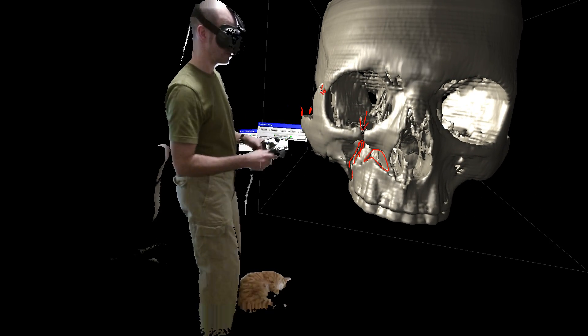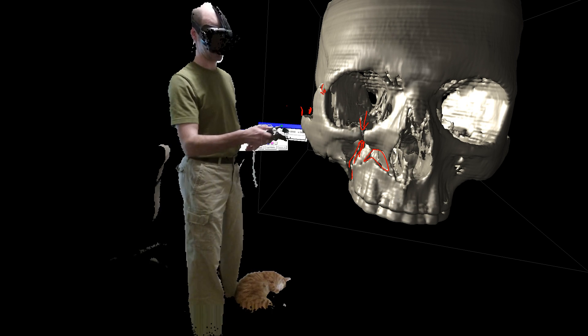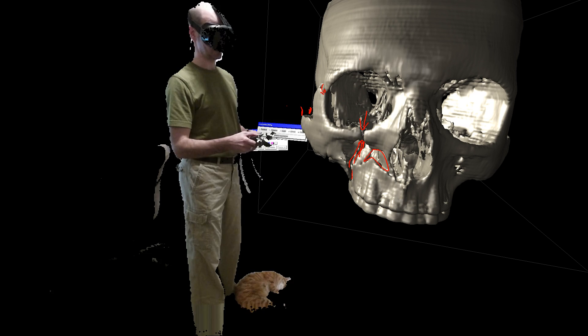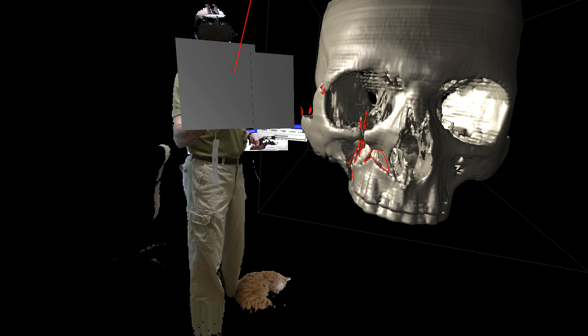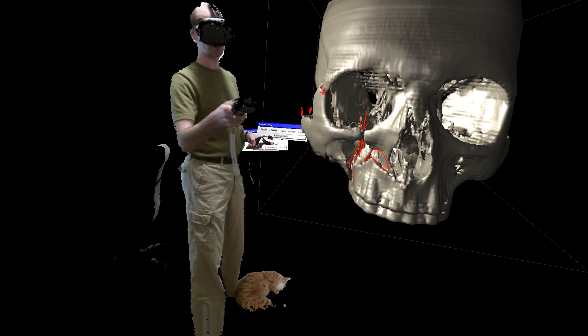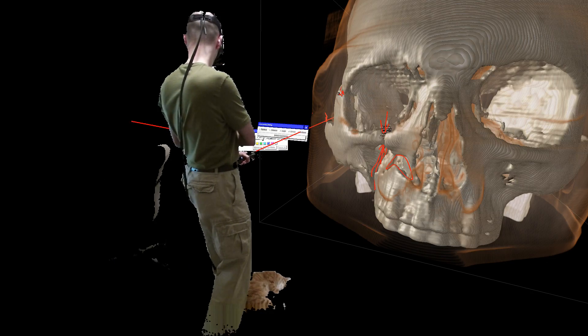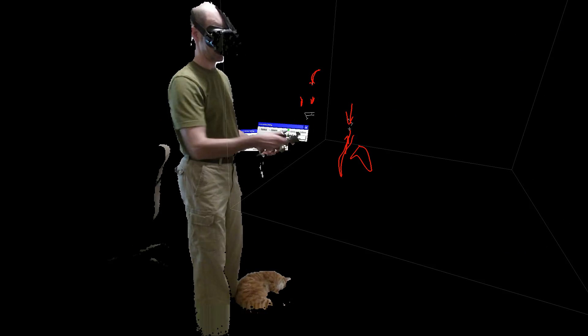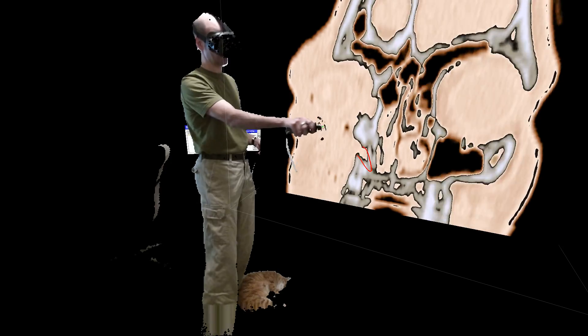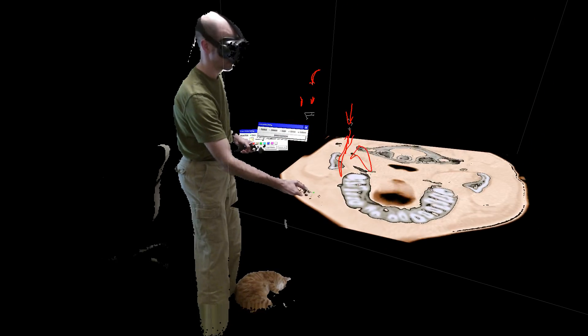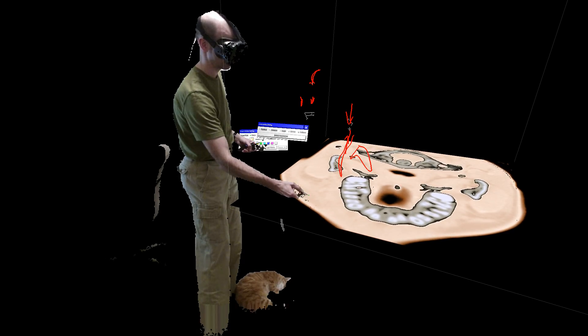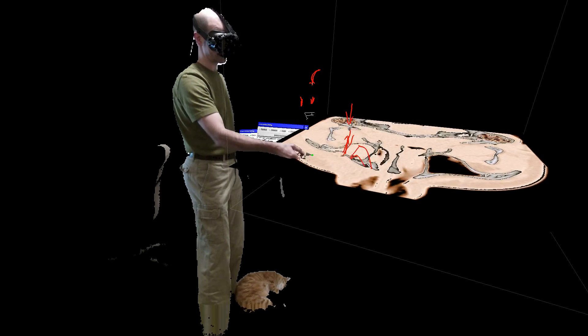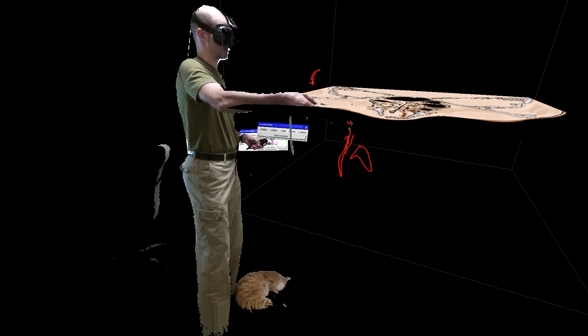So the point being is that when you normally look at CT data like this one, you would be looking at individual slices. We can do that as well. Let me change it over. Slice, and I'm going to make it another tool. Here we go. And so now let me hide the isosurface for a moment. And then if I hold my hand in there and push a button, I can now create a slice. And at this point, now the slices are more or less aligned with how they were originally collected by the CAT scan and then stacked back up into a 3D volume.